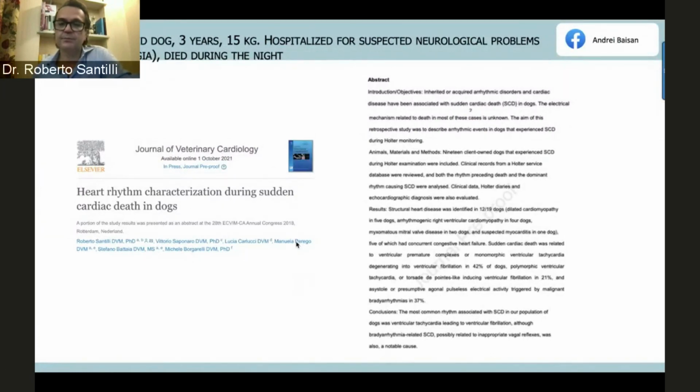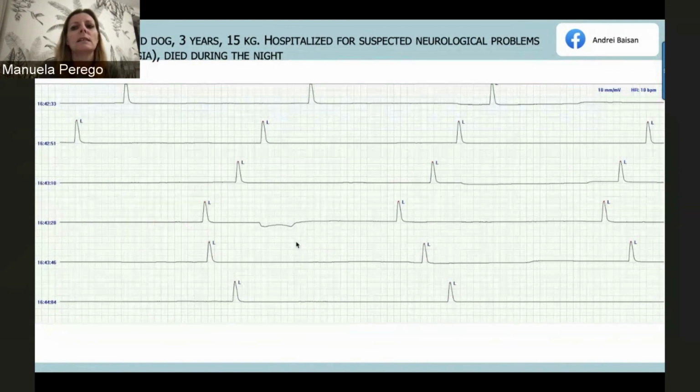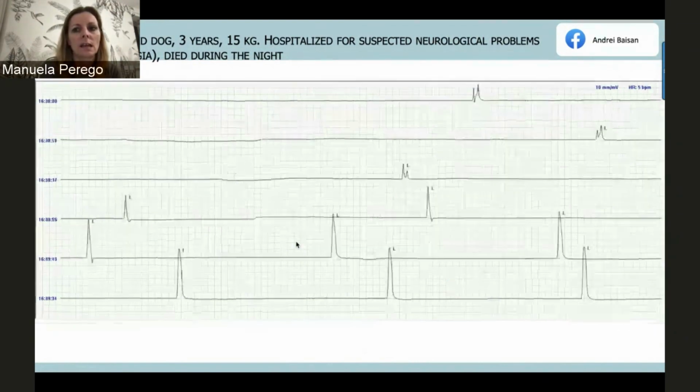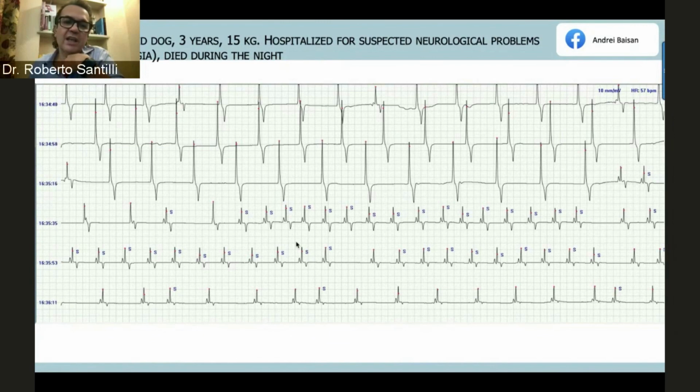All right. So Andre is asking, because the last dog was suspected of polyradiculoneuritis, with tetraplegia: in your experience, is this neurological disease associated with sinus node imbalance or not? I'm not sure that there is this type of association. But what is weird is that we know that sinus node dysfunction is very unlikely to degenerate into agonal rhythm. We never saw it.